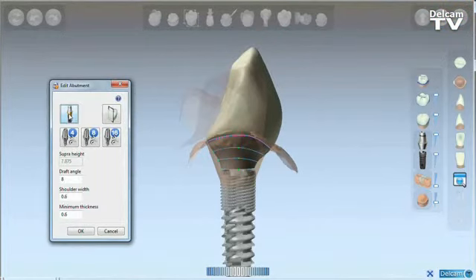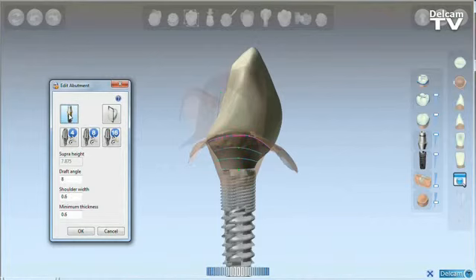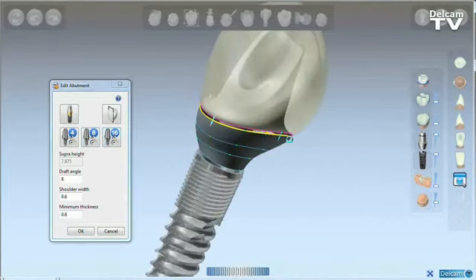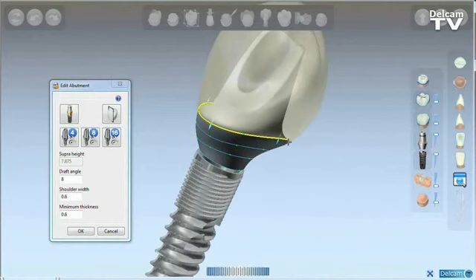In addition to the abutment design tools, we have subgingival editing. We are able to specify a number of control points in which we can define the subgingival shape of the abutment.